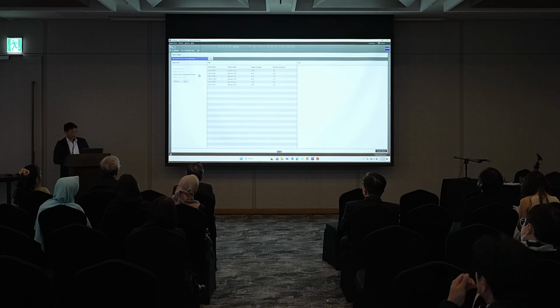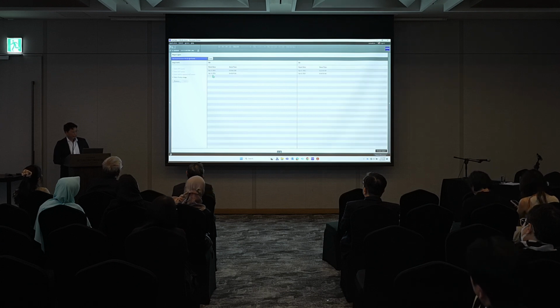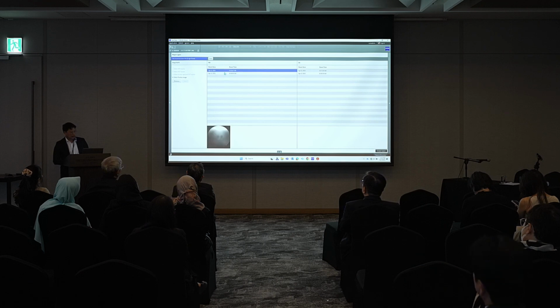Now we've got further optional OCTs. You may or may not want to include that. Here we've got the GCL IPL analysis, so that's always nice to include. Let's choose that. And lastly, we can actually choose a fundus image. So here I'm going to choose the patient's Claris image. And I actually chose this case on purpose for you guys, because here's the patient's Claris image.